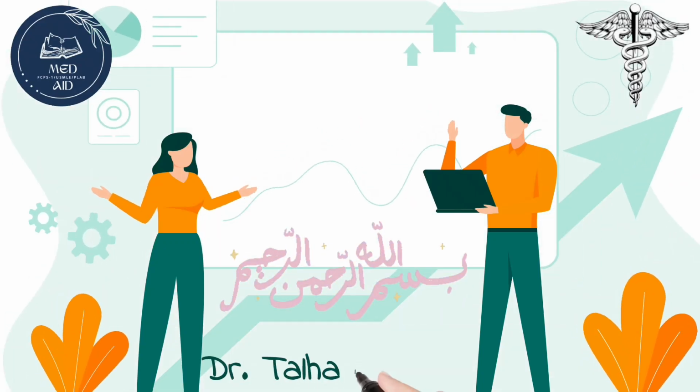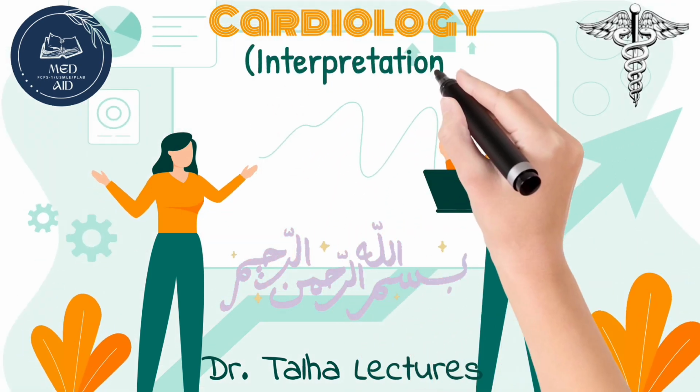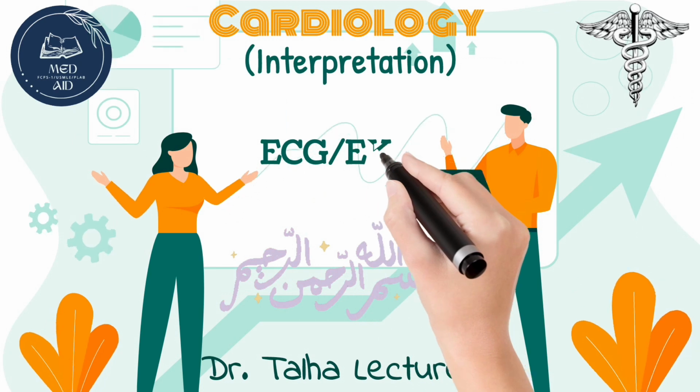We are studying cardiology. Today we will discuss an important topic, that is the interpretation of electrocardiography, called ECG or EKG. So let's start.